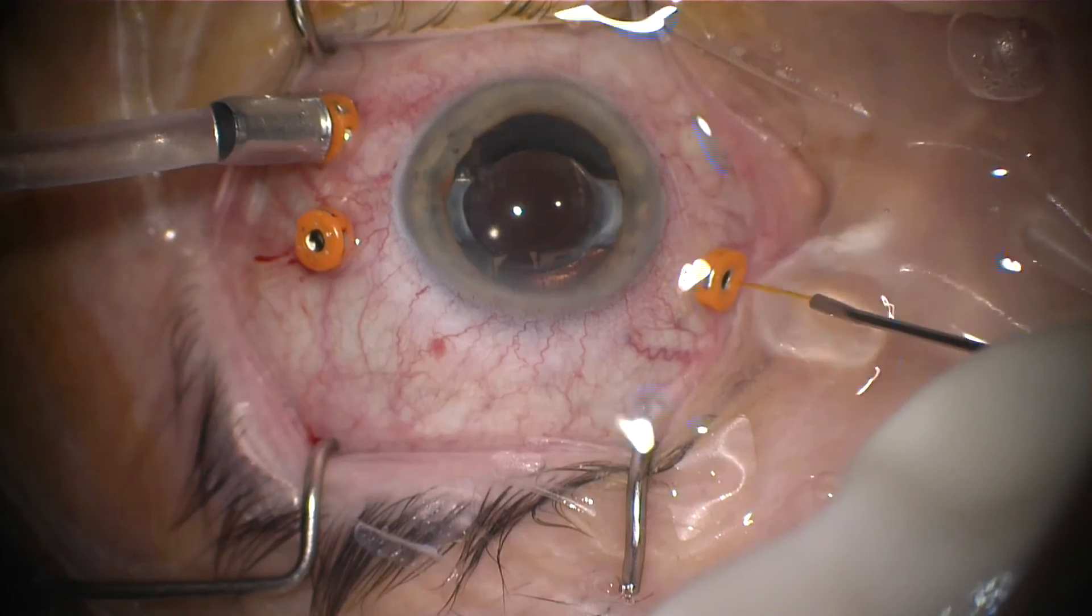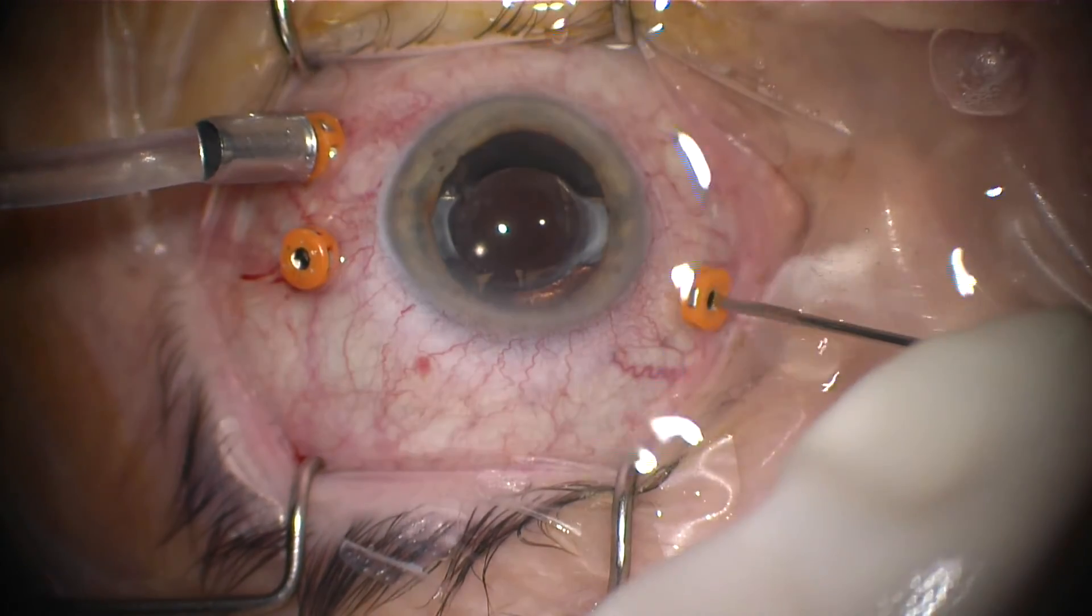This is the 41-gauge microcatheter system hooked onto the MedOne subretinal injection kit.